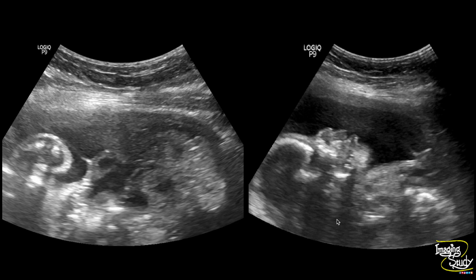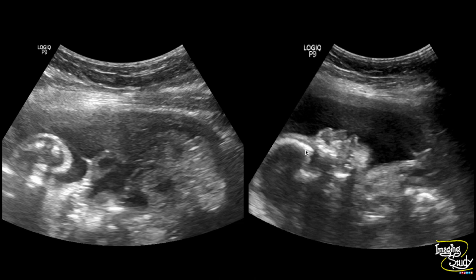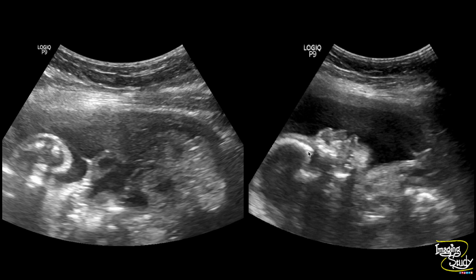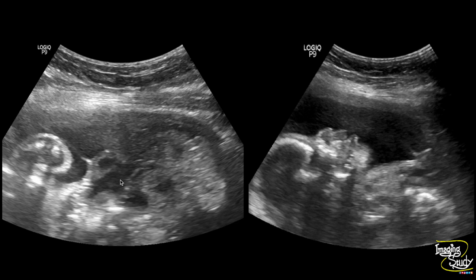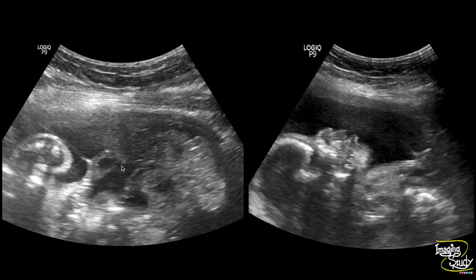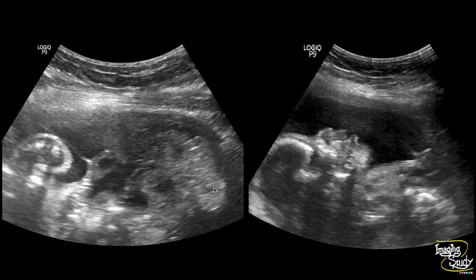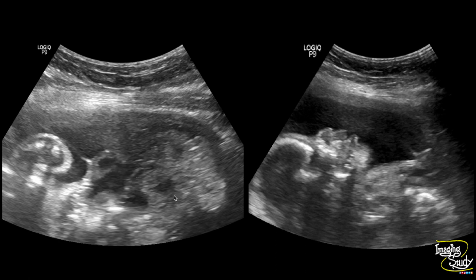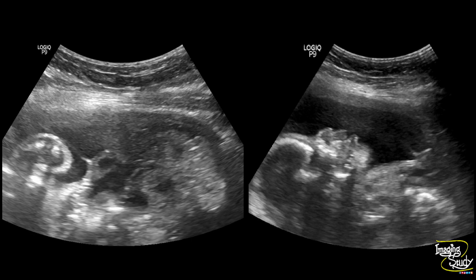Here is the sagittal section of the facial region, which looks quite normal. And again, another picture of the fetal heart outside the thorax, with part of the liver and intestine outside the abdomen.